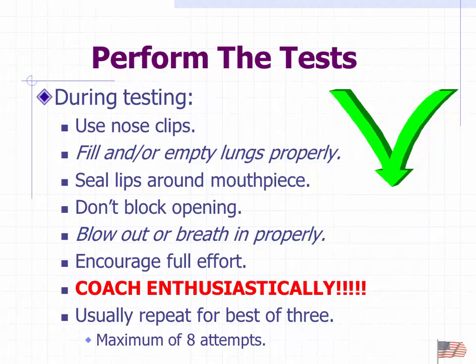Sealing of the lips is tough for a lot of the aged. They don't have really good control, so there are lots of leaks. We have to evaluate that. For some tests like the peak flow meter, you don't want them to block the opening where they're exhaling. It's kind of like a duh. It's not going to measure well if you're blowing against your hand. Make sure they're exhaling slowly if we want, or forcefully if we want, and at full effort. And nothing is better than an enthusiastic therapist yelling and screaming at the patient to work harder.